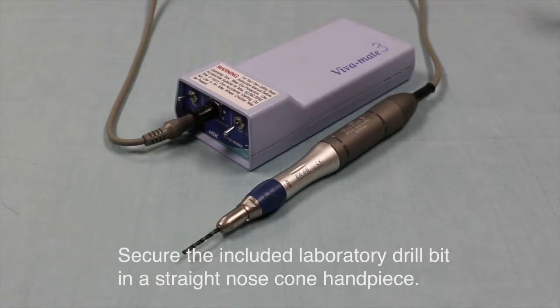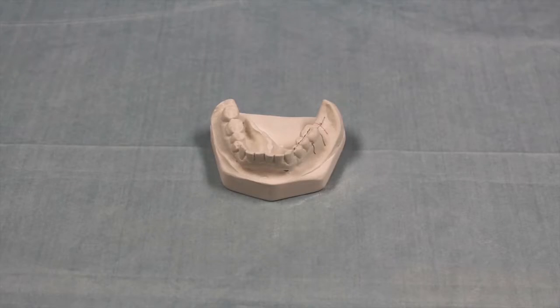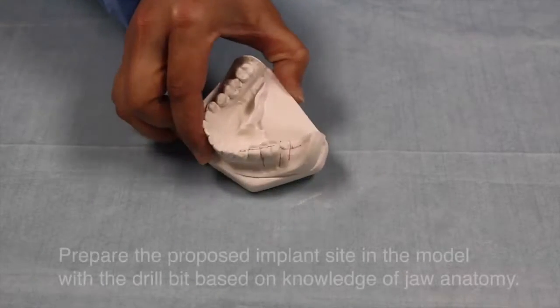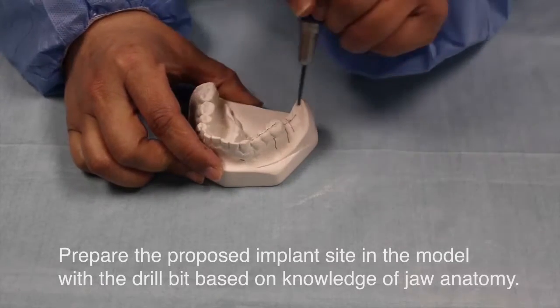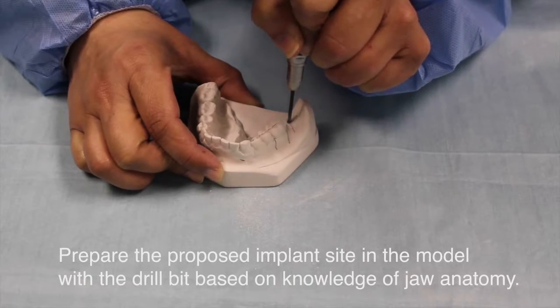Secure and include a laboratory drill bit in a straight nose cone handpiece. Prepare the proposed implant sites on the model with the drill bit, based on knowledge of the jaw anatomy.